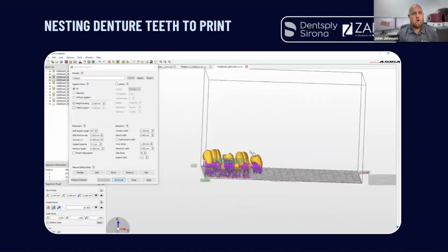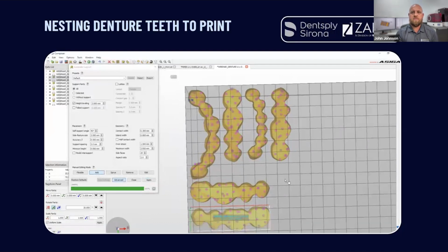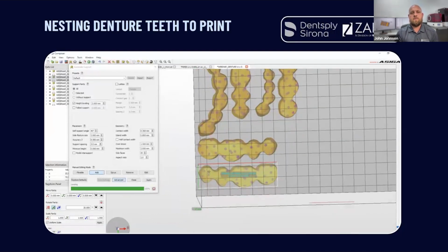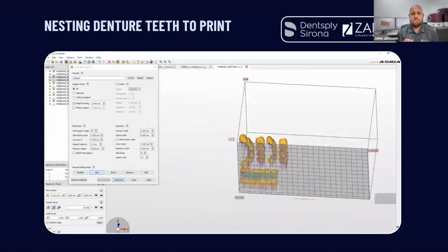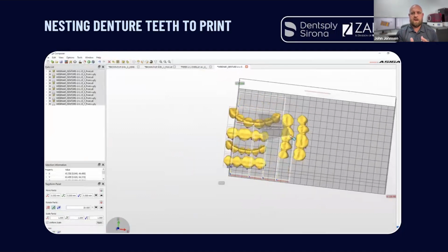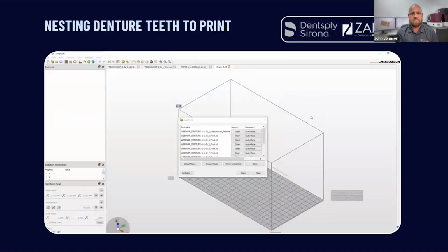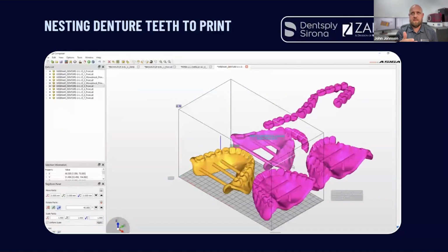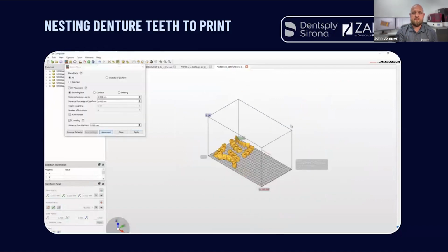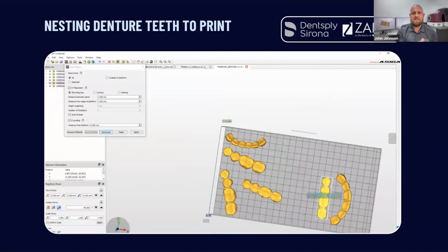Now it generates supports. Now I always go and check. I don't just trust the system. I always go and check to see if there's any need for new ones. And one thing to note with LDP, all of the connectors between the teeth is really where the zero gap is in the design. So when you go to finalize your design, it's going to ask you how much glue space, and it's preset. I think it's a preset of 0.17 is that glue space for that fused material. And then the zero to actually make it seat is in those connectors. So you really don't want supports in those connector areas if you can help it.